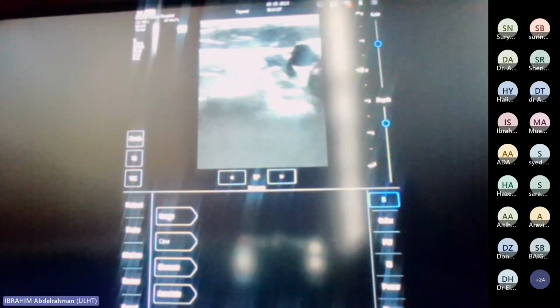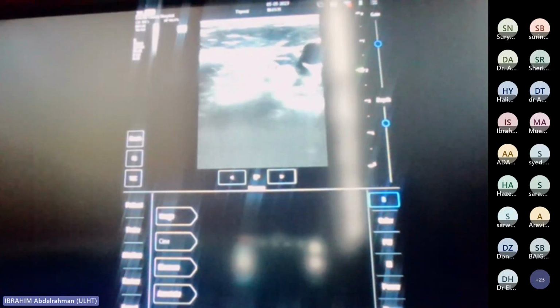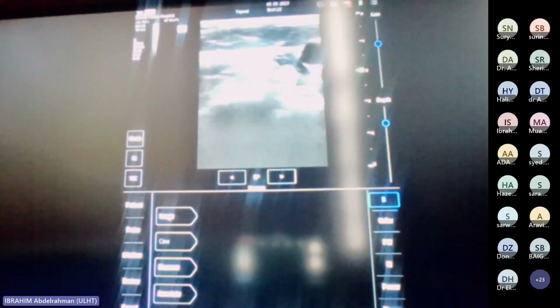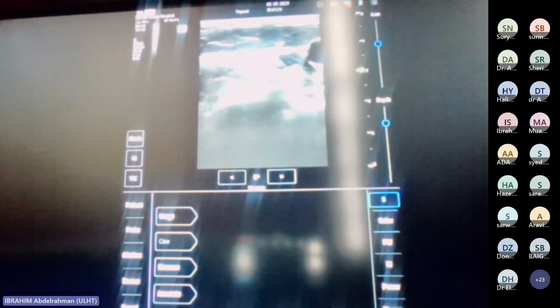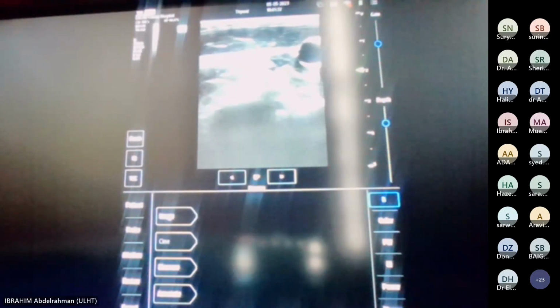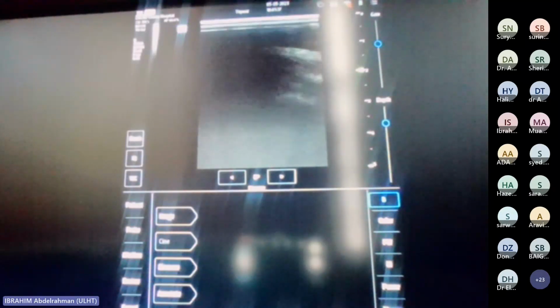So say that I found the lymph node at this level. Now if I put a mark, the mark should be on top of the node. You're then going to biopsy it. Yes, exactly. So I'm talking about taking a snapshot, going to theatre and doing a surgical marking. Sometimes it happens with us that we use the ultrasound to find it in the theater. So I would come and mark it.